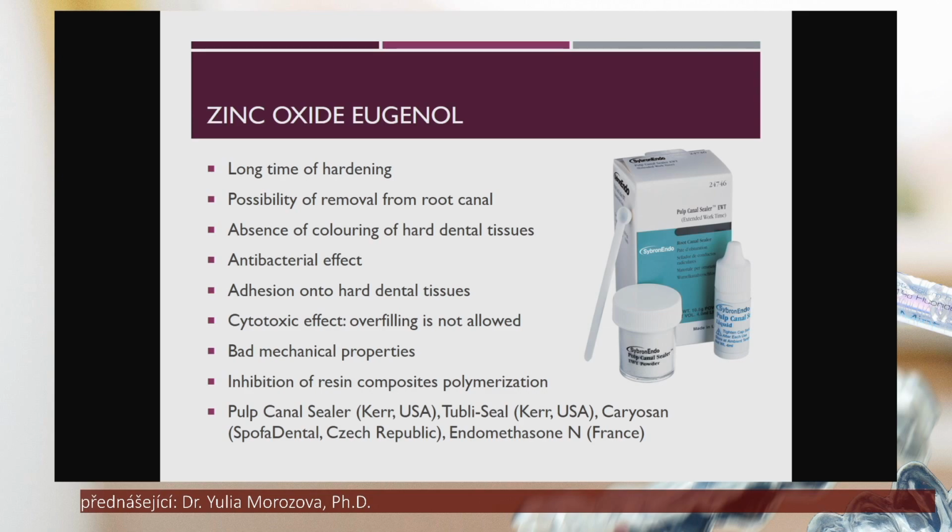Zinc oxide eugenol based sealers, these types of the sealers are used relatively long time in endodontics. They have long time of hardening. They are possible to be removed from the root canal if it's necessary. They don't lead to the staining of hard dental tissues, have antibacterial effect due to eugenol content. They provide the adhesion onto the hard dental tissues, but also they have bad mechanical properties and cytotoxic effect.